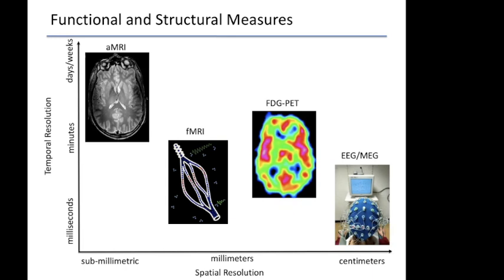With a lot of the algorithms that we're going to talk about today, for test-retest reliability, meaning you put me in the scanner, you take me out, you put me back in, and you acquire one image of my brain each time, most software will give measurements that are about 95, 96% reproducible on the low end in structural MRI. fMRI, and certain EEG to a lesser extent, but fMRI certainly suffers from a lot of these issues with reliability, and that's something to consider when you're looking at longitudinal designs. So we're going to talk about that today.